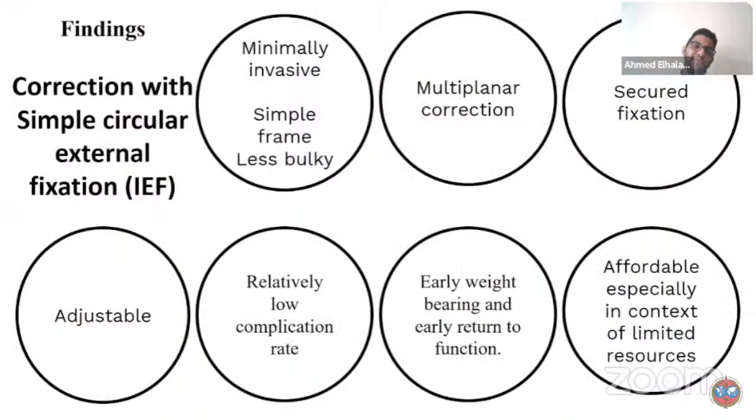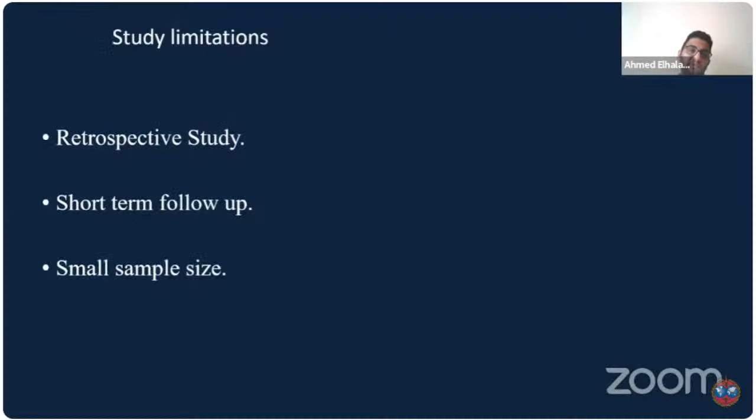Our finding when we use this technique, especially in limited resources, is that it is minimally invasive. It's simple and the frame is less bulky, and at the same time it achieves multi-planar correction and secure fixation, and it's adjustable, with a relatively low complication rate, allows early weight bearing and return to function, and is affordable in the context of limited resources. Our study limitations: we acknowledge that it's a retrospective study, with short-term follow-up and a small sample size.